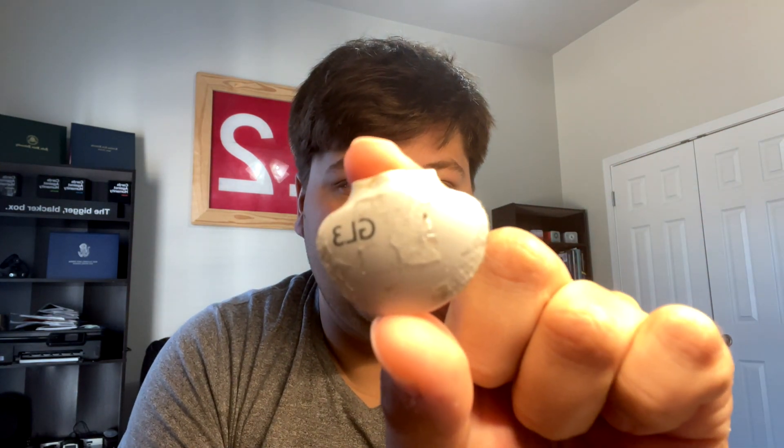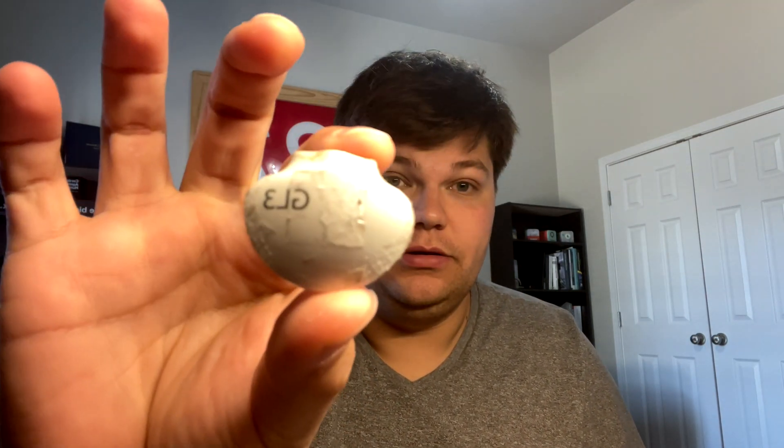Today we're going to talk about the Guardian Link 3 transmitter. I have a semi-dirty Guardian Link 3 transmitter here — someone requested how I personally clean my transmitter. I have a spare one for this video; the one I'm currently wearing isn't very dirty. This one has some adhesive on it, so let's dive in and talk about what comes in the Medtronic Guardian Link 3 transmitter box.